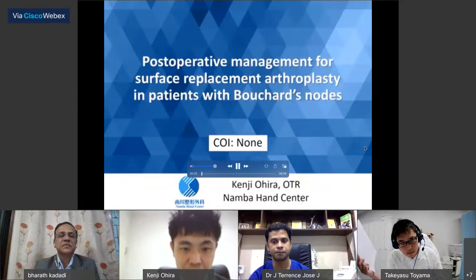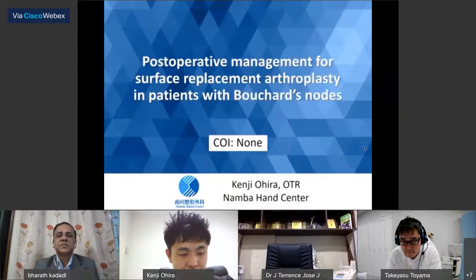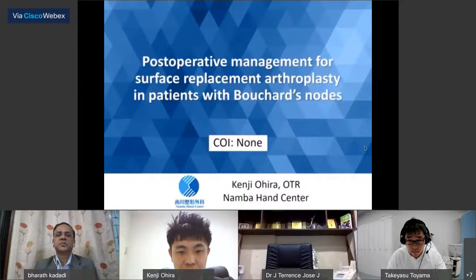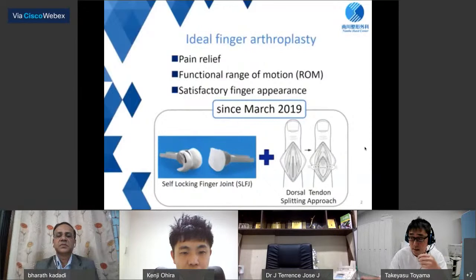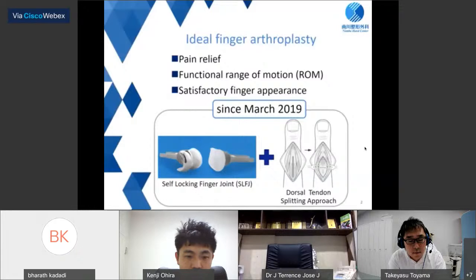Finger implant arthroplasty is still a controversial topic today. I will talk about our recent work on surface replacement arthroplasty in patients with Bouchard's node. The ideal finger arthroplasty is to provide pain relief and to restore a functional ROM and finger appearance. Since about 2019, the surgical technique in our clinic was changed to the use of a self-locking finger joint with a dorsal tendon splitting approach for patients with Bouchard's node.